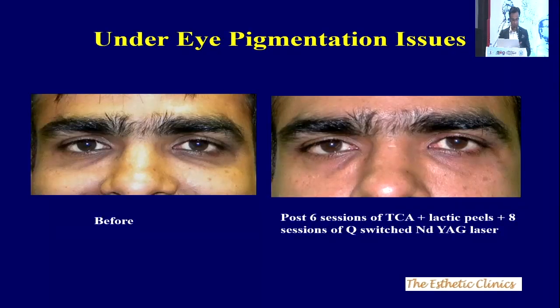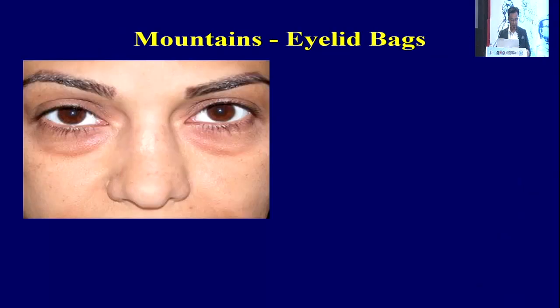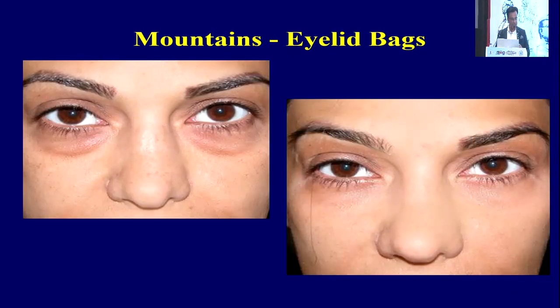Now let's look at some of these patients, right? Look at a combination treatment of trichloroacetic acid peels, lactic acid peels, and some Q-switched Nd:YAG laser, and the difference that that creates. Look at this patient who otherwise would have been a surgical patient, but we treated with fillers and some CO2 laser on the skin side to tighten the skin in order to make these disappear, right?